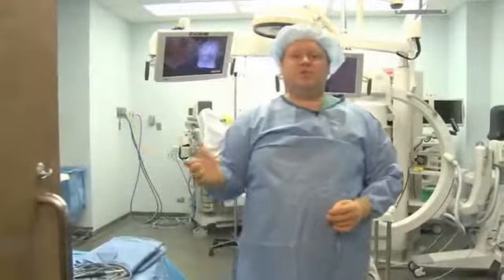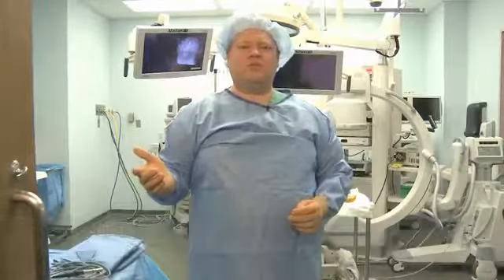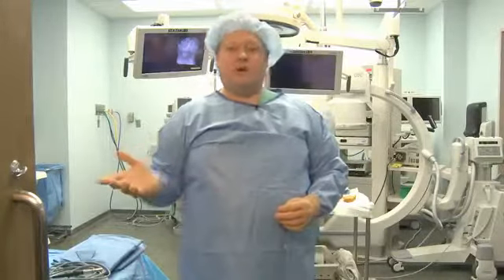Okay, so this is another procedure we used to do on our old cysto table. It's a patient with gross hematuria. We're just going to do a cystoscopy. Not quite sure what we're going to find.